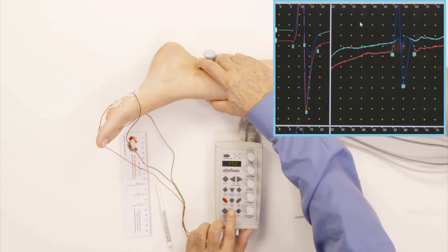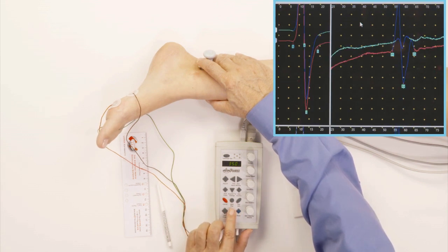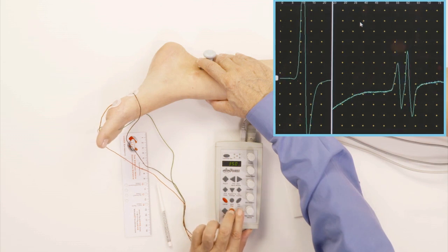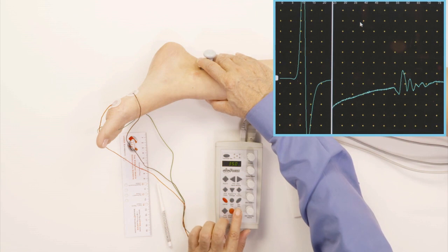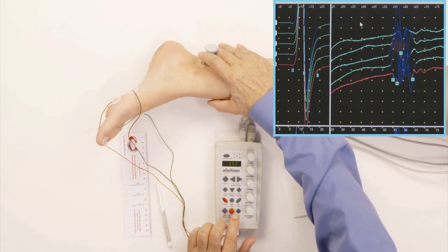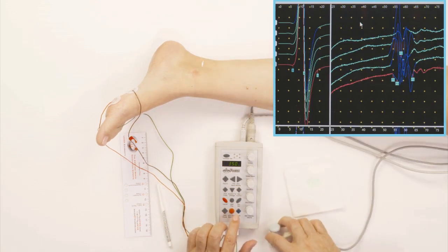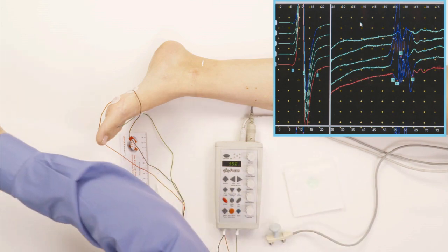Here's another nice one. It's wonderful. I accept that. Here's another one. I noticed I didn't have to ask her to make a fist here. She had very good F waves in this muscle. I accept that. Now we're done with the F wave.